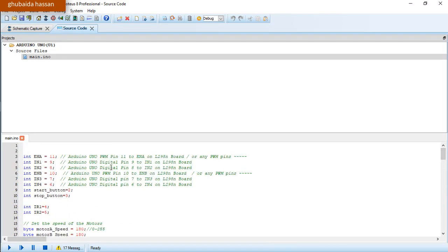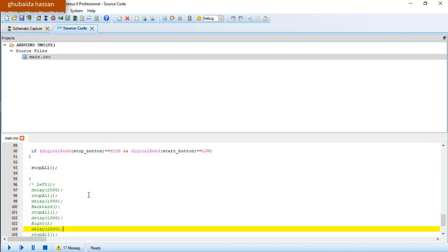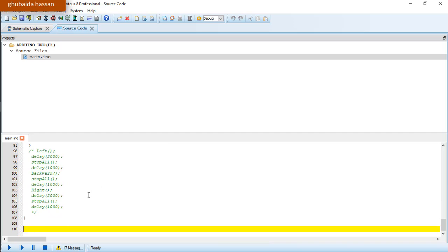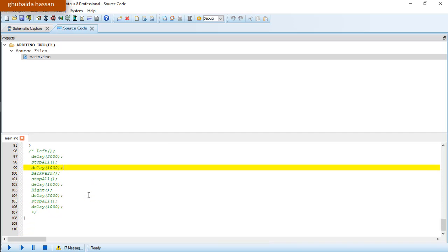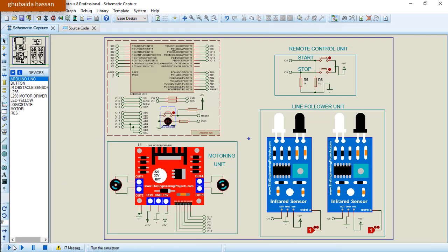This is my Arduino program. Okay, I've already compiled it, so it's fine. So let us simulate our project. Click this button here to run the simulation.